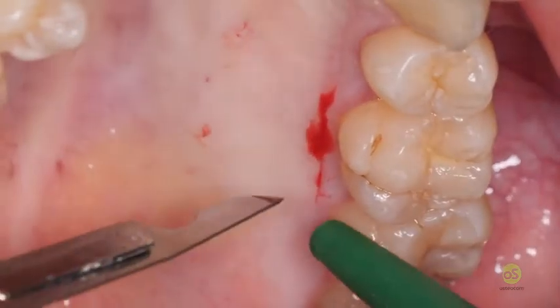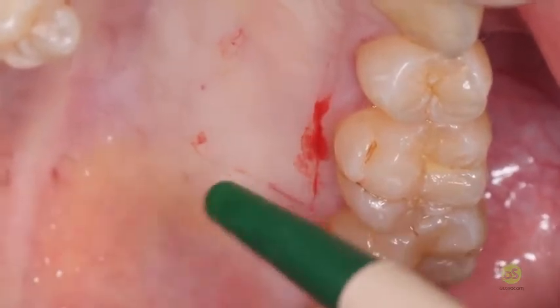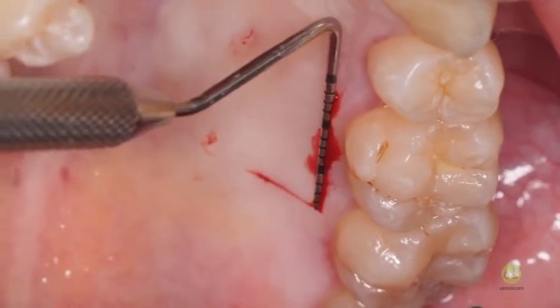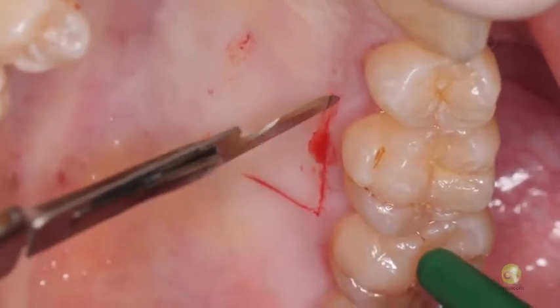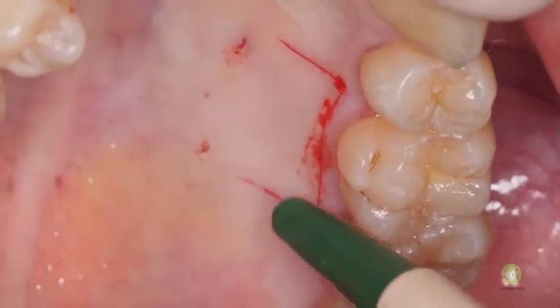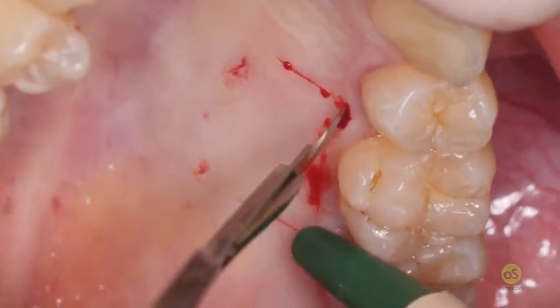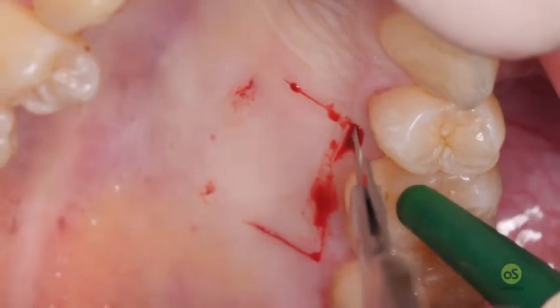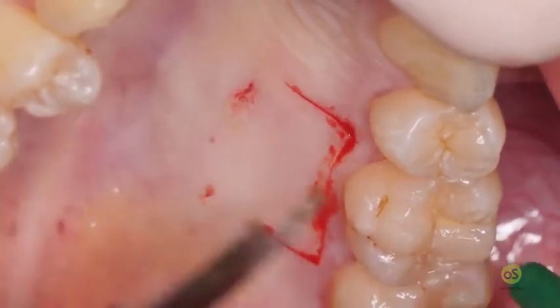I make the vertical release incision 5 millimeters long, and then I measure again in order to be sure that I have 13 millimeters before making the second one. Same rules as before: bevel, thickness, calibration of the graft by rotating the graft at the level of the mesial angle.